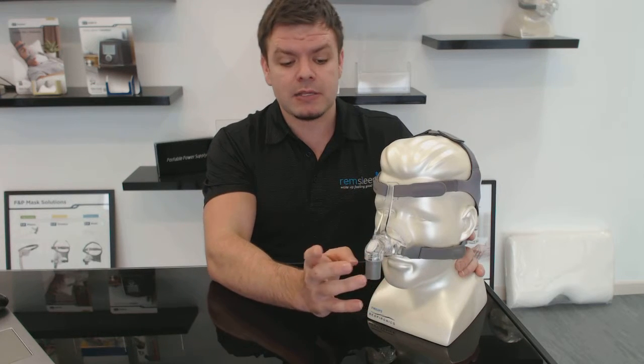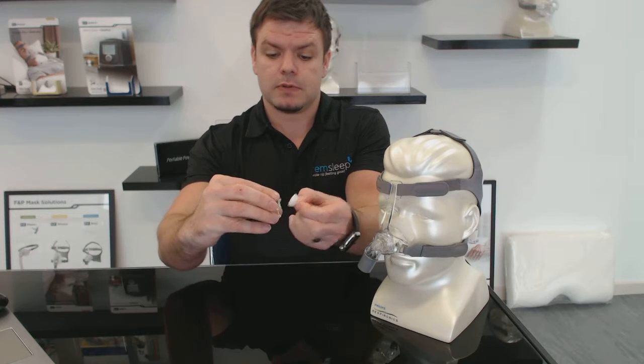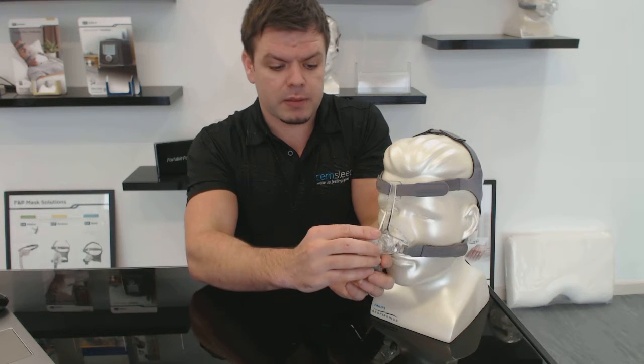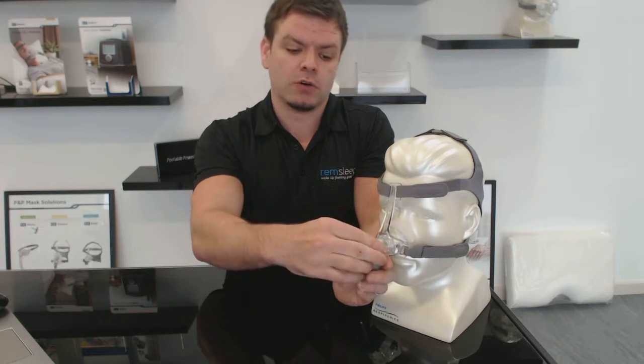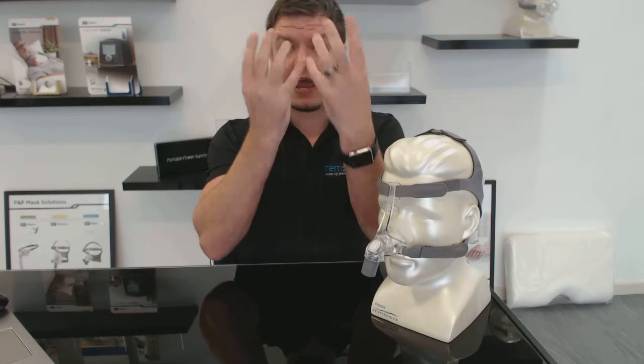One of the things I really love about this mask is that on the exhalation vent it has a filter. I'll just take that off and show you — it's a little bit of filter material that sits in this part of the mask that goes over the exhalation holes. The exhalation holes are where the air escapes from the mask as you're exhaling, so the carbon dioxide and the air you breathe out escapes through those holes.